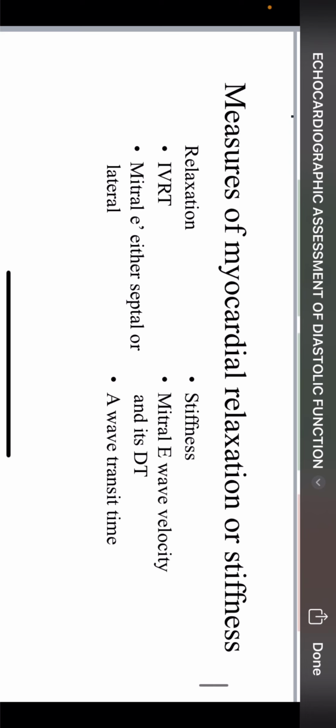Causes of diastolic dysfunction. When you're doing an echo exam and you find any of these, just know diastolic dysfunction is there, and what remains is to grade it. If you find hypertrophy, it doesn't matter whether it is hypertensive heart disease, hypertrophic cardiomyopathy, restrictive cardiomyopathy, or aortic stenosis, or pulmonic stenosis, diastolic dysfunction is there. Just grade it.